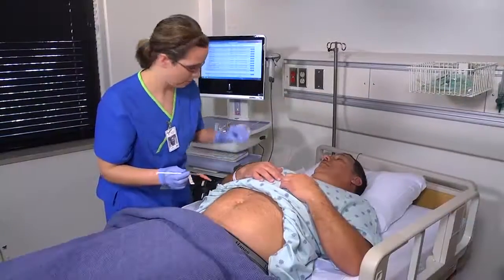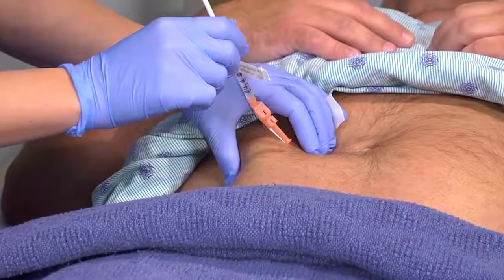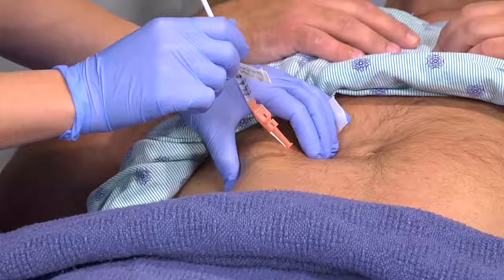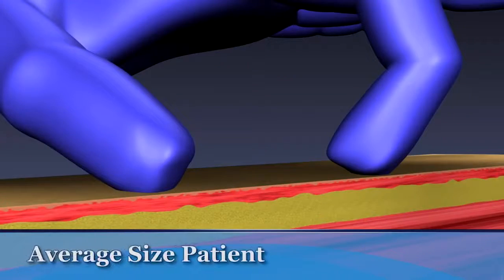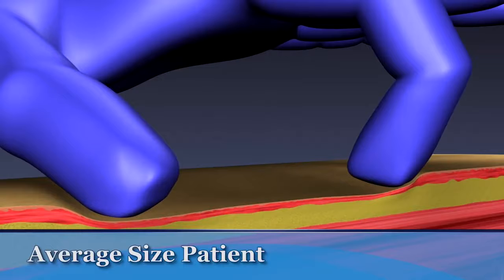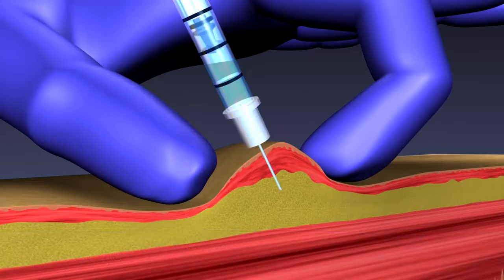Remove the needle cap or protective sheath on the syringe by pulling it straight off. Hold the syringe between the thumb and forefinger of your dominant hand as though you were holding a dart. If your patient is of average size, hold the skin across the site or pinch a fold of skin with your non-dominant hand. Insert the needle quickly and firmly at a 45 to 90-degree angle.